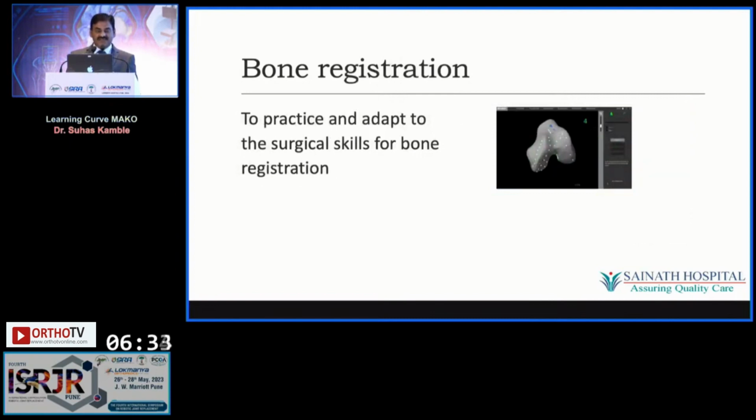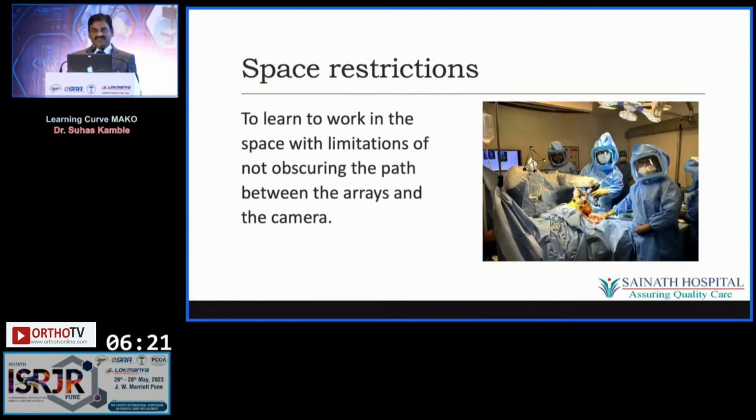We need to practice and adapt the surgical skills for bone registration. So, I mean, how deep we need to press the probe on the cartilage, and how much on the bone we need to just touch, because the CT scan understands the bony landmarks.